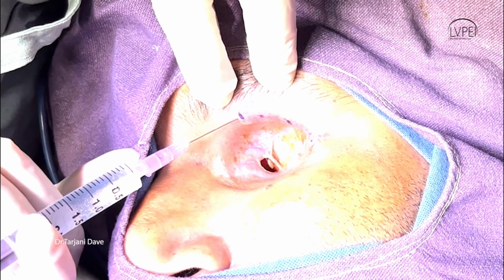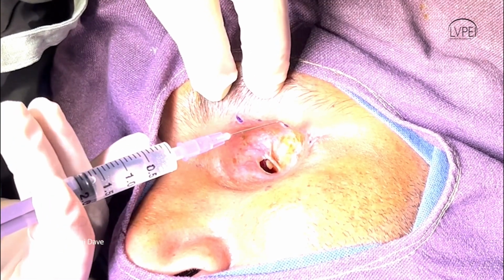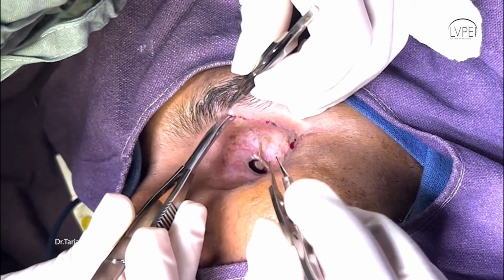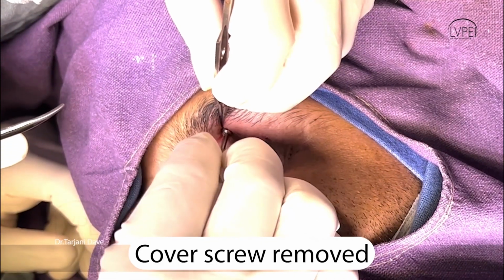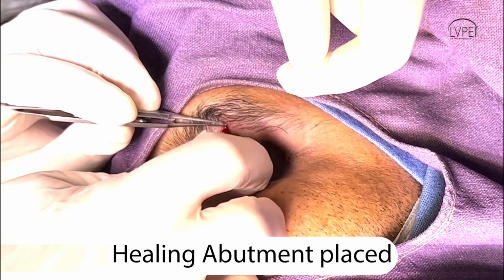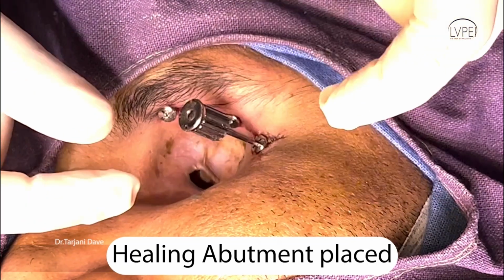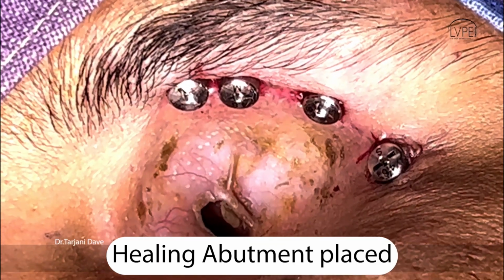The cover screws are palpated over the skin and the skin markings are made. Local anesthetic agent is infiltrated subcutaneously. With a number 15 blade, small skin incisions are made to expose the cover screws, and the cover screws are removed gently. Healing abutments are placed inside the implants now in order to form a fistula around the implant. So the basic concept behind step 2 is that the cover screw is removed from the implant and the healing abutment is placed in order to form a fistula and is exposed to the outside.